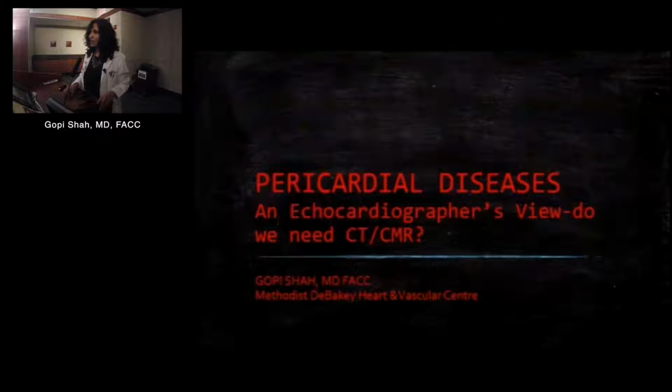There is no blanket that you do A, B, C, and D in any particular order. So the use of the resources we have has to be tailored to the question we are asking, the therapeutic implications, and what it really adds to the basic imaging that we do. Echo plays a very fundamental and basic role, and I'm going to go ahead and start with that.